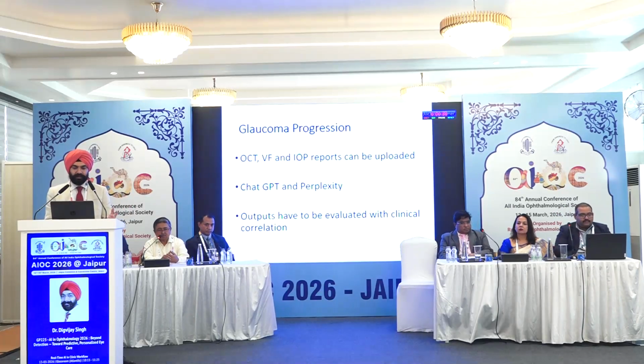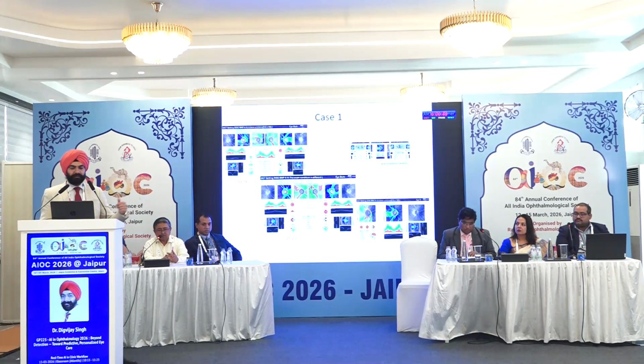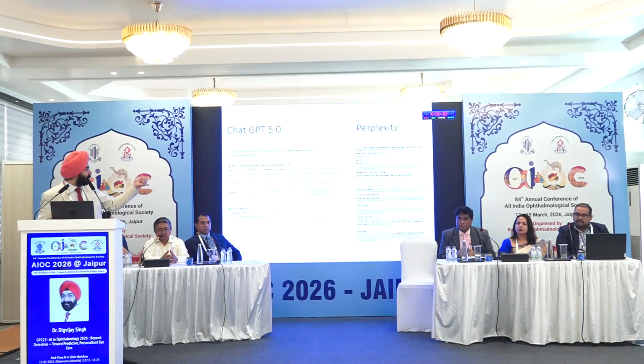The other place I use AI is in glaucoma progression, and I'll show you through some cases, and this is something all of us can do. We simply upload a few pictures of, let's say, the OCT RNFL on software like ChatGPT or Perplexity, and they would give us outputs which look like this.